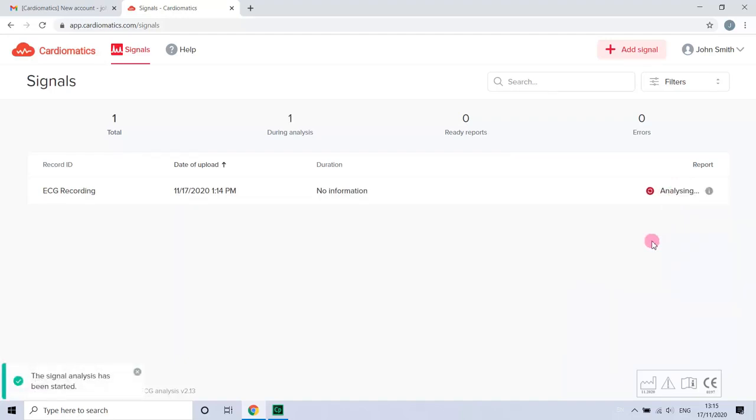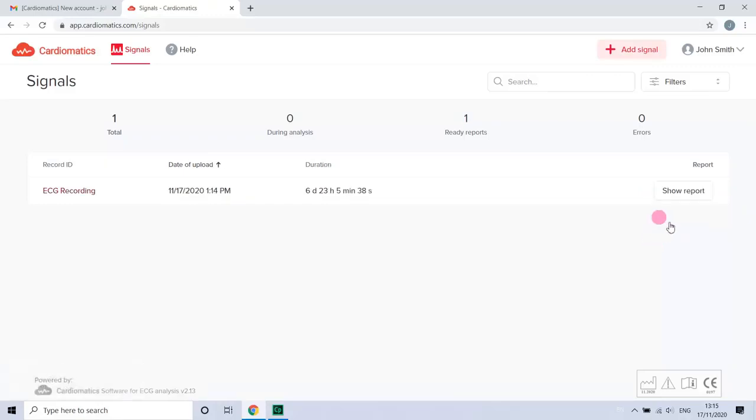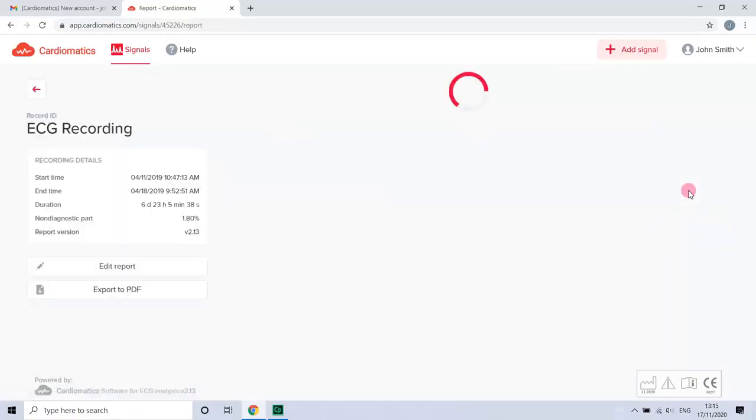You will see the recording is being analysed. Remember this takes on average 2 hours but may take up to 5 hours. Each final report goes through a quality check by our team.